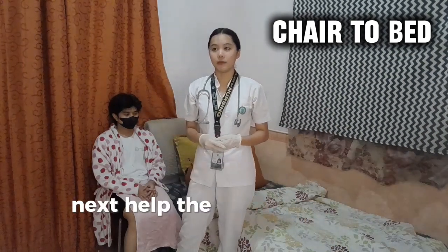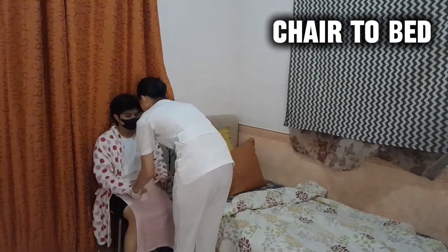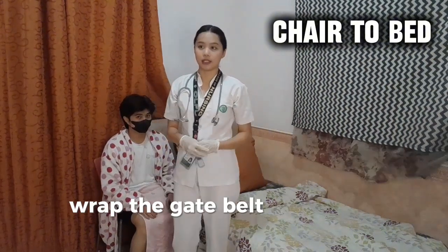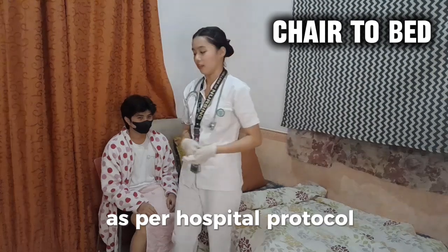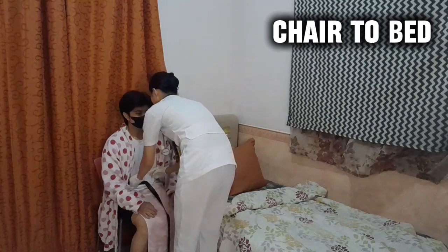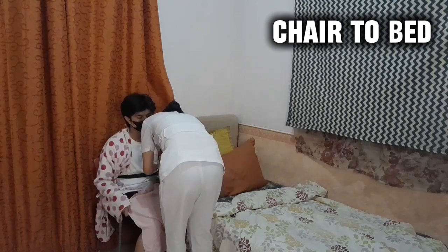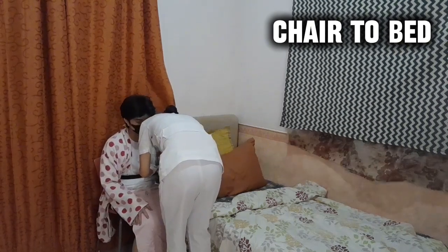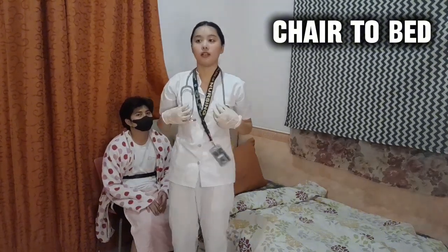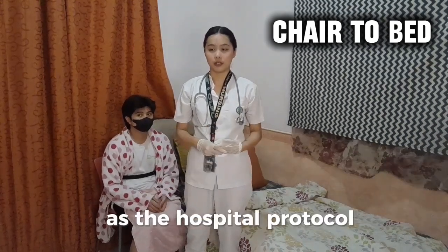Next, help the patient to scoot forward on the chair until their feet reach the floor. Okay. And then 9, wrap the gait belt around the patient's waist as per hospital protocol. Sir, I will wrap this gait belt for you.